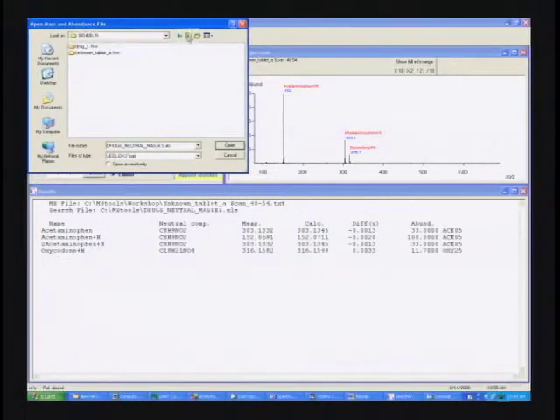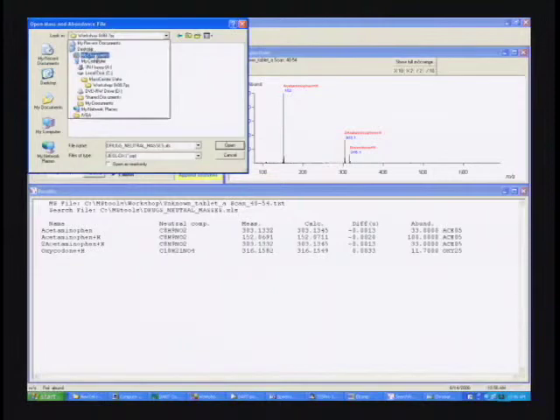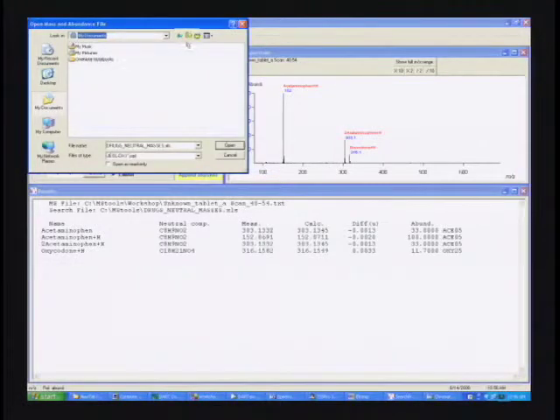Well, all right. Not there. Here we go again, gentlemen. I screwed it up again.